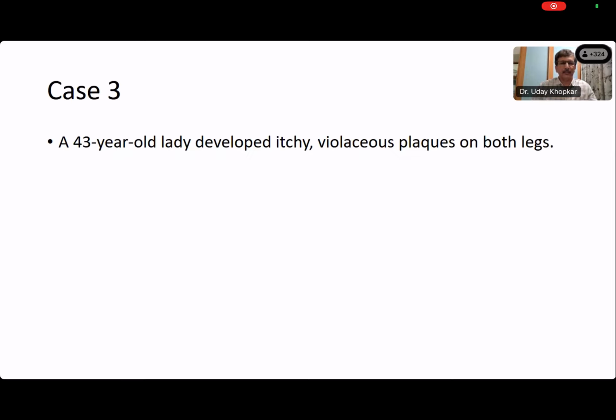And the three stages: acute, characterized by vesicles or edema, and edema in the dermis as well as in the epidermis with spongiosis; and subacute, with a combination of hyperplasia of the epidermis and this spongiosis, as well as a bit of parakeratosis and a scale crust. And chronic, which Dr. Rajlakshmi has already shown as lichen simplex chronicus, which is the end stage for most of the eczemas.